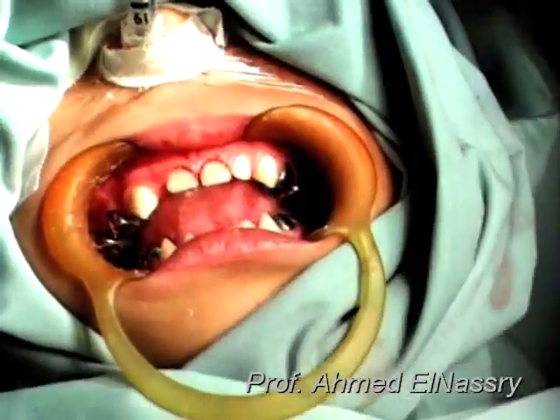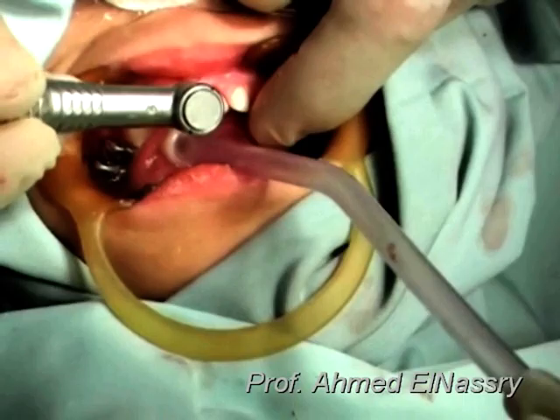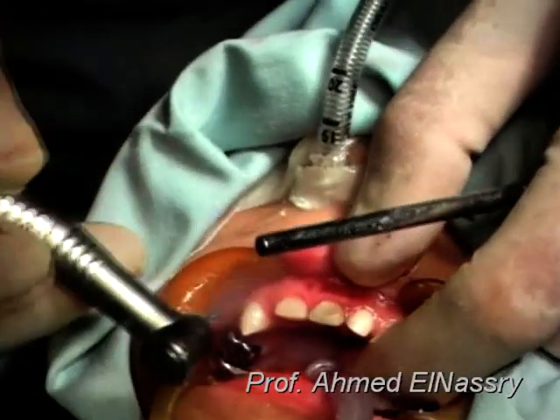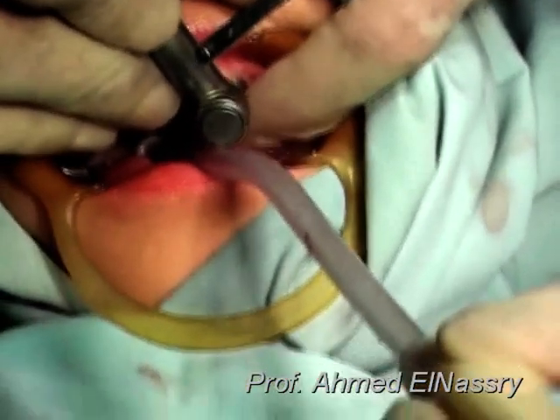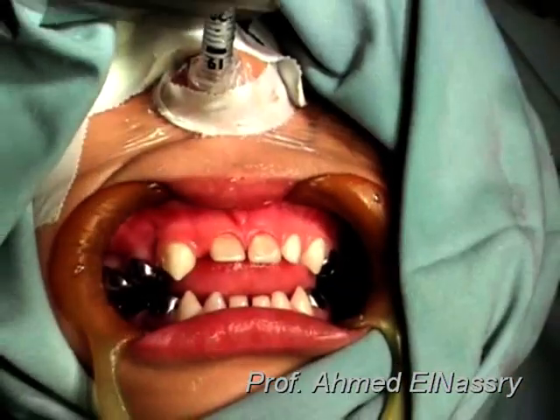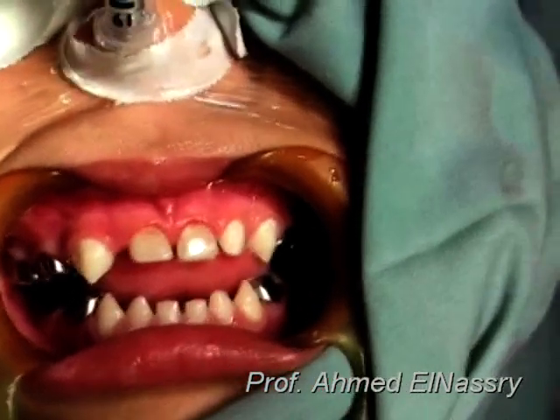And then start to finish the composite restoration. This is the finished case. The anterior primary teeth are restored with composite celluloid crown technique, and the posterior teeth with stainless steel crown.